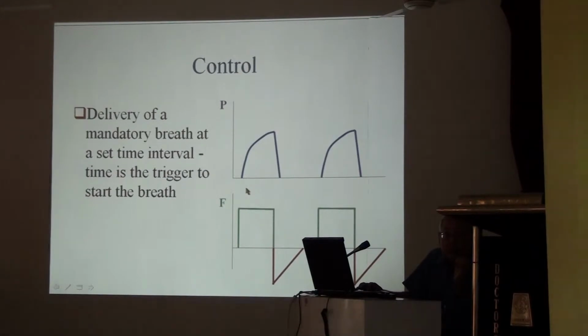Initiation means the inspiration has started, the machine starts delivering, and the pressure gradually reaches a target. And cycling, the end of the inspiration: it suddenly drops because there is no airflow from the machine side, so there is a drop in pressure, it goes down, and then there is a gap. The gap may be an exhalation process, or it may be combined with a pause. For your understanding, this is an inspiration, this is an expiration, pure expiration.